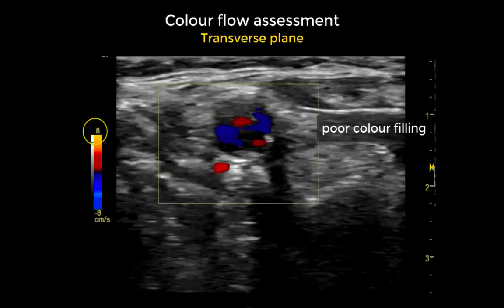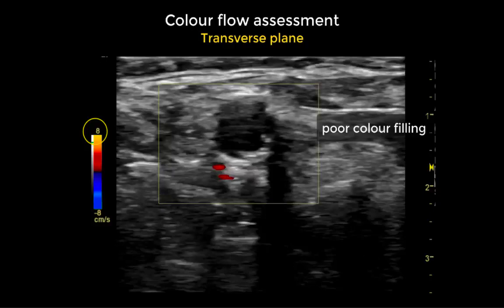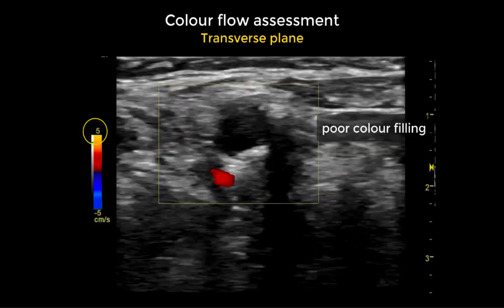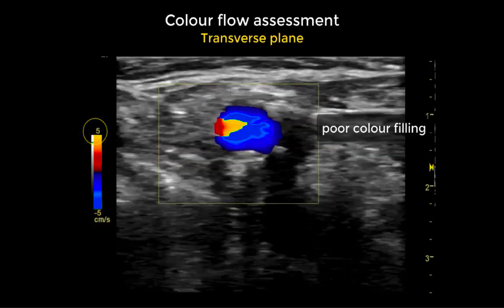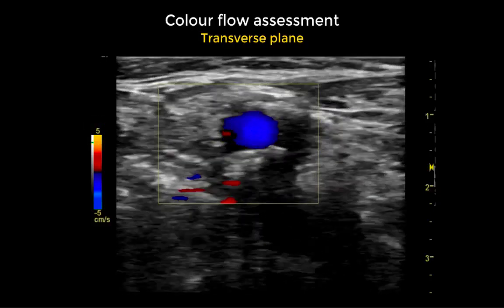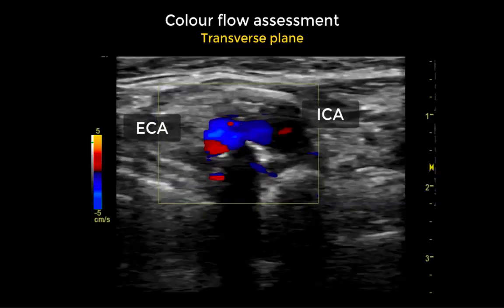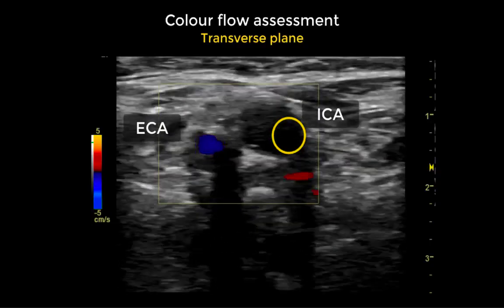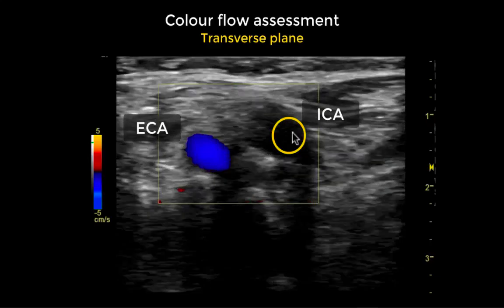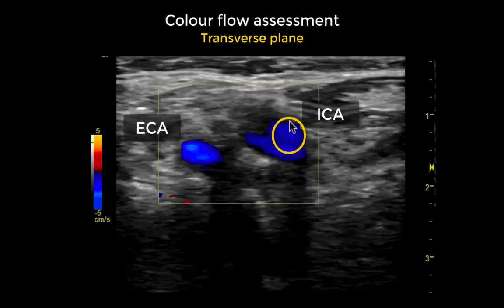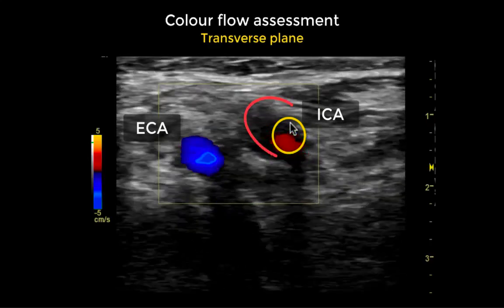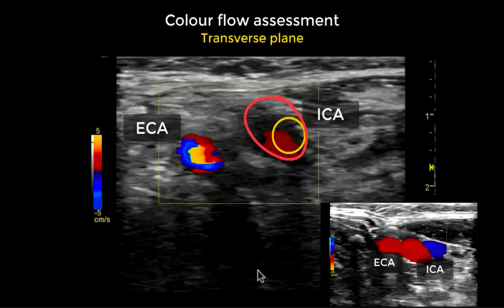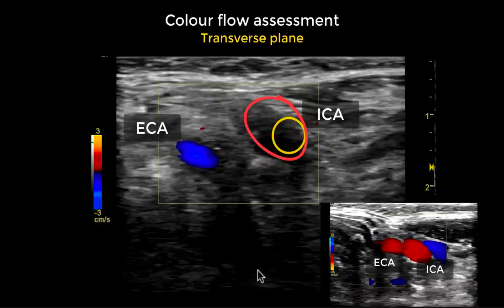We lower the scale as low as we can to better the colour filling; however, we can still see a filling defect within the internal carotid artery. Only part of the lumen is filled with colour flow, while the remaining part of the artery is not filled.